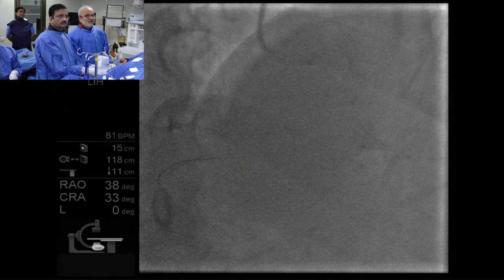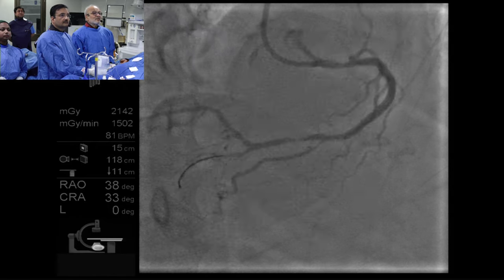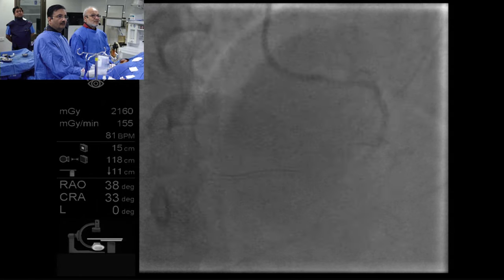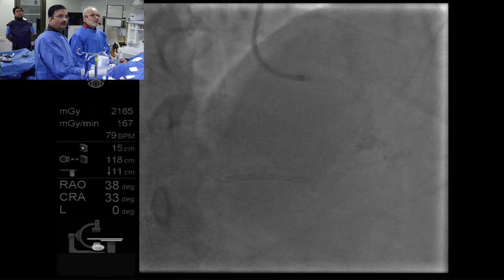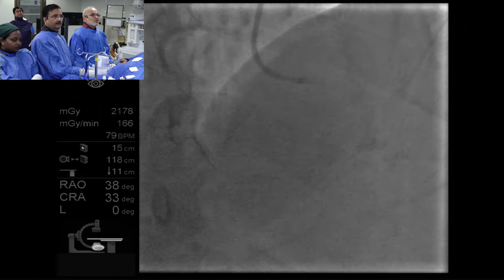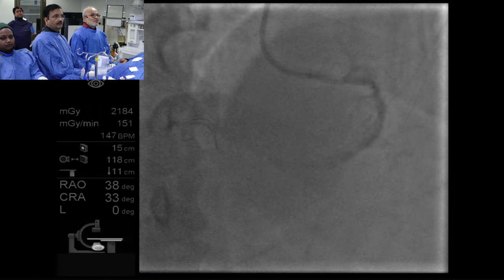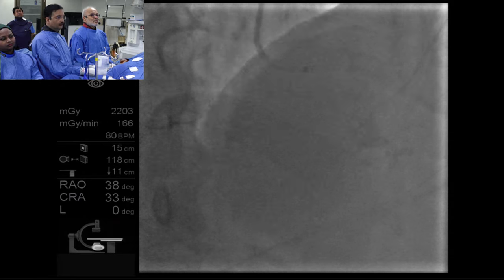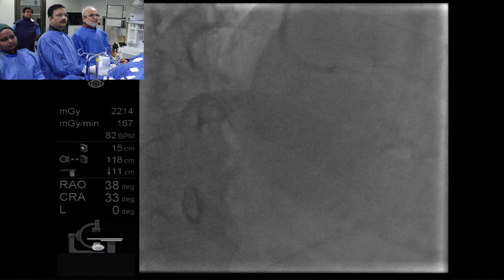The upper branch. Sanjay asked me to go to the higher branch. Let me check it out. It will give better support also if I go to the upper branch. Yes. Scout. Fine. But then I have to be careful not to go into the sub branch. Okay. No, still, we take some time. No, this is okay. We scout.